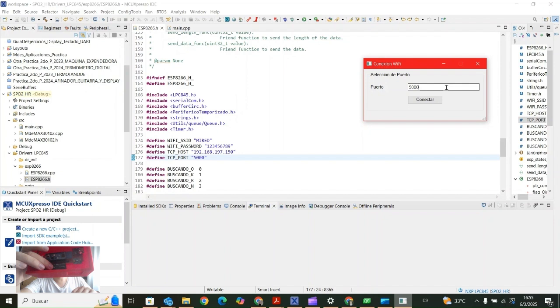Typically you won't have the box opened. The finger would be placed like this, in this position. You can use your index finger or this finger as well, as you like. The distance between the finger and the sensor should be almost nothing, as close as you can, but do not touch the sensor itself and don't move the project. For the presentation, I'm going to just let the box and the project itself steady on the table. We should not move anything.